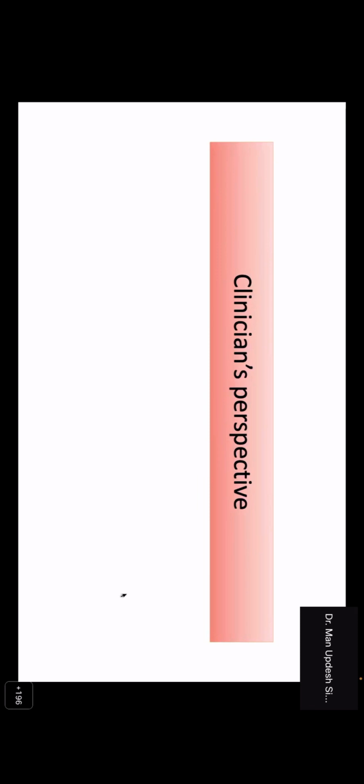Remember, megaloblastosis is a systemic disorder. Any cell which is proliferating in the body will be affected. Sometimes people diagnose megaloblastosis in pap smears because of megaloblastic changes in the nucleus. So the myeloid lineage is always affected; the extent depends on the individual. Sometimes the erythroid series might not be affected to that extent, whereas the myeloid series might be affected more.